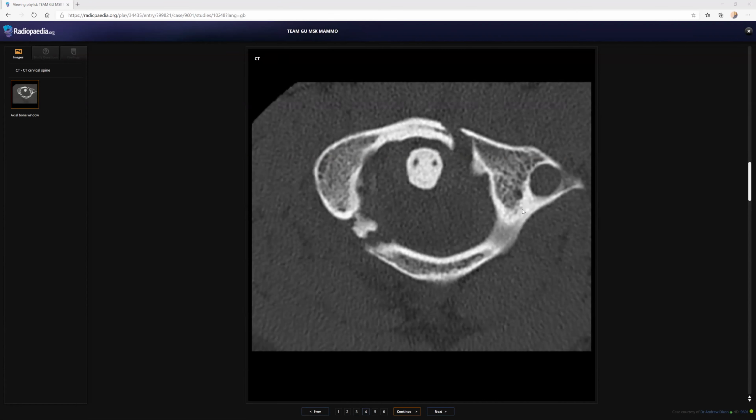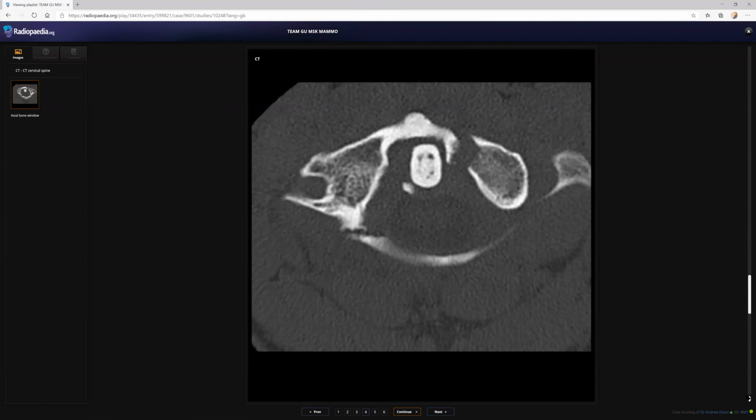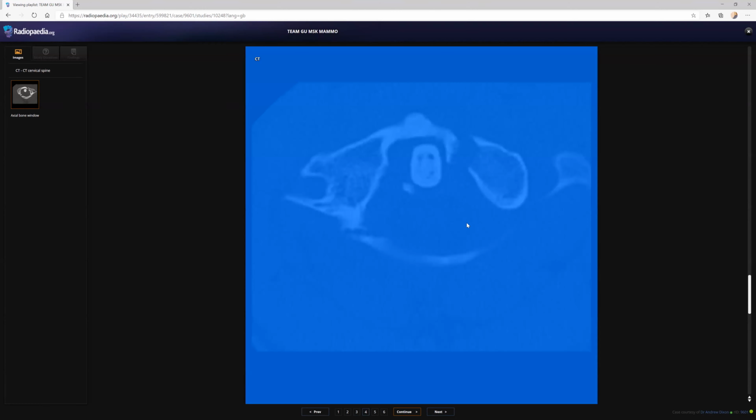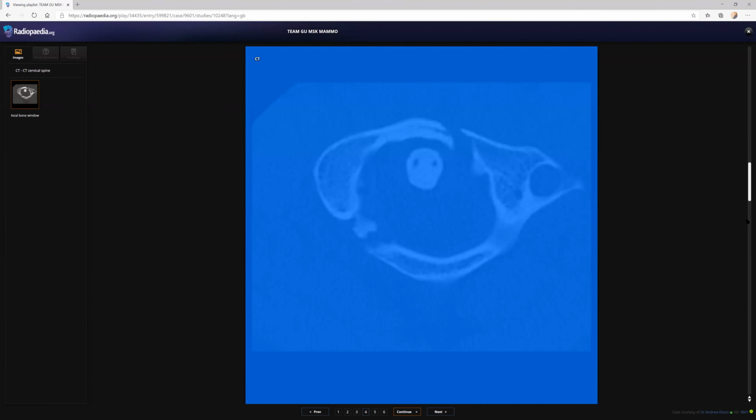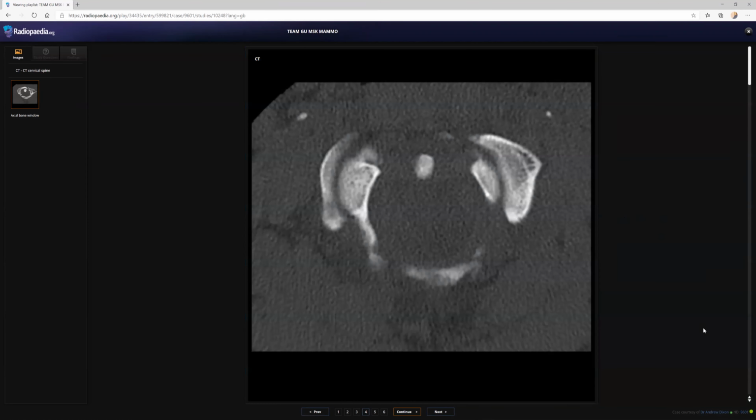So if one anterior. Now I have given you the remote control, so you can scroll. Hold on. I don't know, I think it's stuck. No, I cannot scroll it. Sorry. You can keep the mouse over the arrow. Don't double click. Don't click twice. You can just keep the arrow here and go up and down. Otherwise, no other movements. I think it's better if you do it because I'm stuck with it. I cannot do it, so I'm giving up the remote to you. Now you can scroll. Sorry for that.